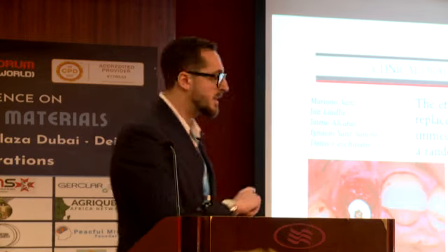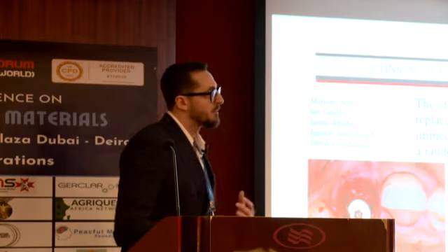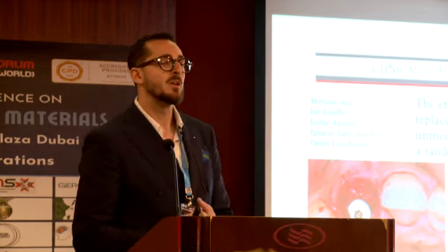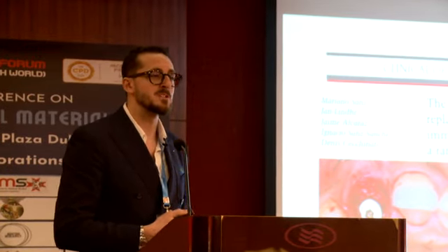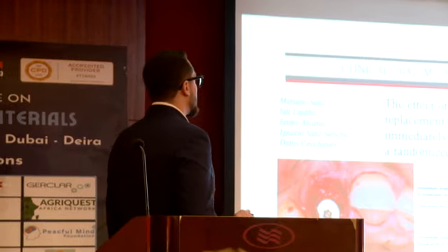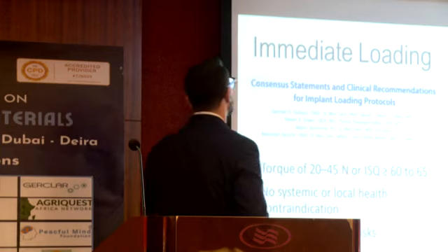bone. In this case, I always try to use bovine bone, but I have to ask the patient, due to religious reasons, if they can receive the bovine bone or not, receiving the porcine bone instead. But I try to explain that I prefer the bovine bone due to a better stability in time, but I have to understand also the patient's reasons. In this case it was a DBBM bone. So basically I always graft my gap.